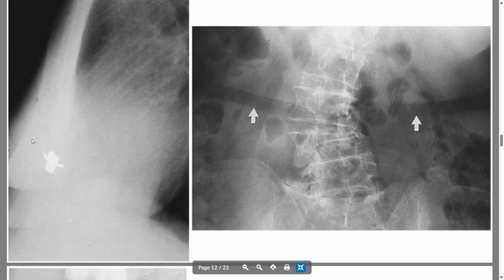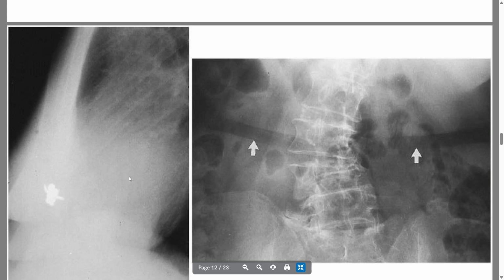Patient body habitus, so you can see a little bit of like the rolls in the soft tissue here. But most importantly, we're looking at this radiopaque density here. And so typically when we're looking at something like this, we're thinking, okay, is it a clothing artifact? Are they wearing something that has something metallic on it? Were they properly gowned in that way? Do they have something that maybe is embedded in them, a surgical artifact, or maybe a foreign object? In this case, this is a CR machine that took this image, and this is a bee that got stuck inside of the cassette.